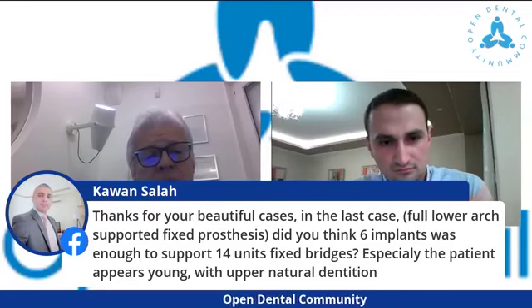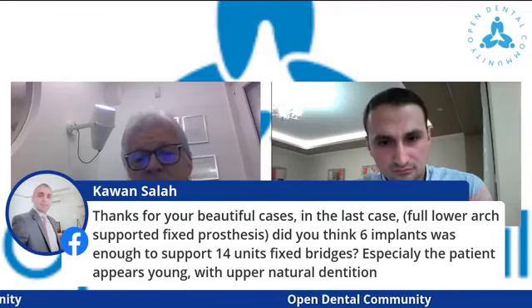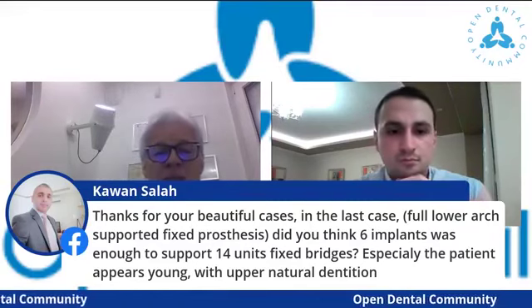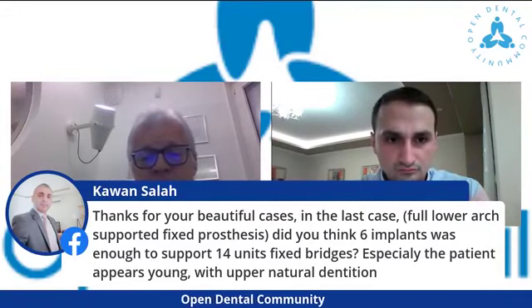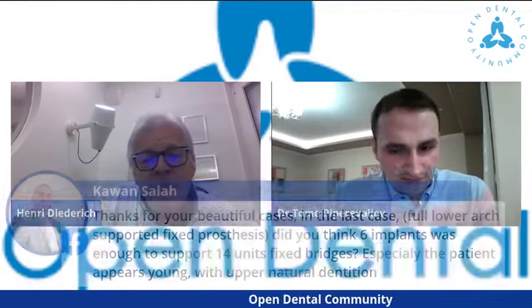Another question here from Kavan Salah. Thanks for your beautiful cases. In the last case, full lower arch supported fixed prosthesis, did you think 6 implants was enough to support a 14-unit fixed bridge? Especially as the patient appears young with upper natural dentition. Yes, the patient is young, around 40 years old, I think. But he has good quality of bone, and we inserted implants longer than 10 millimeters. And I'm sure that we are not going to have problems in this situation.